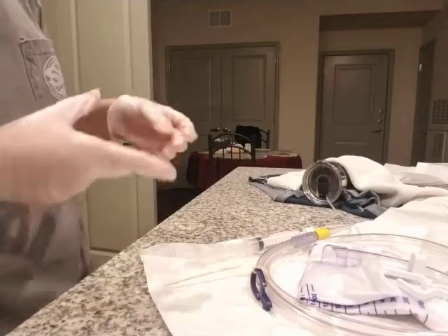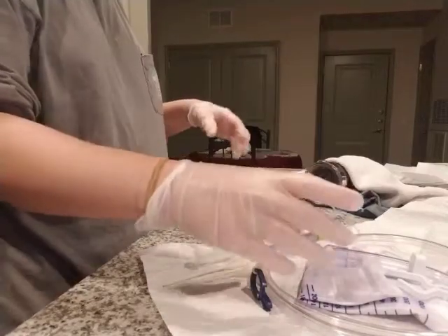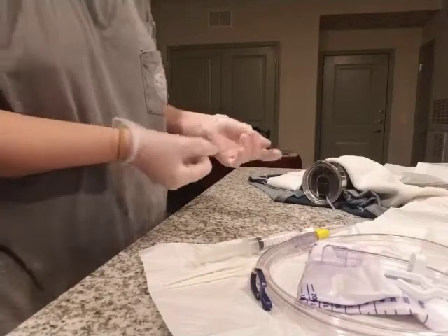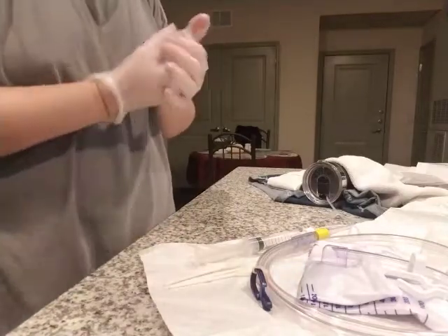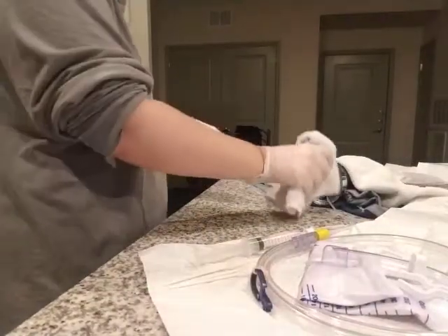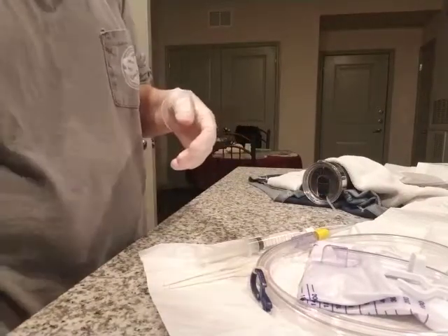And then I made sure when I was taping it to the inner thigh that the drainage bag is below the bladder so that it can have free gravity flow. And I would hook it onto the bed frame and not the side rails. I'm going to cleanse and dry the perineal area. And I'm going to re-drape the patient.